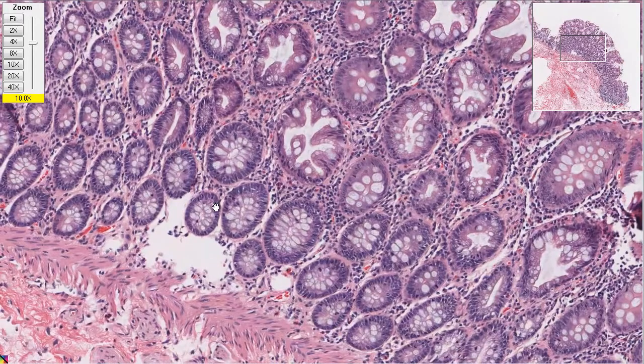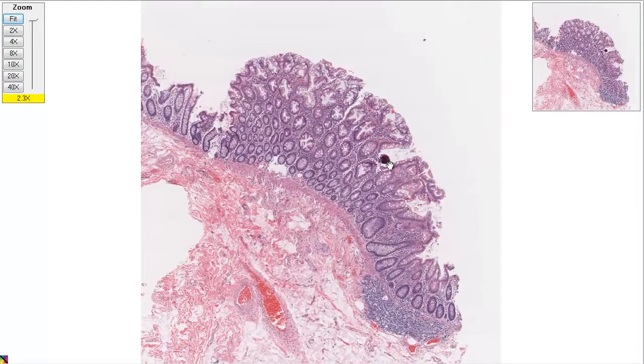There's some stimulus that was causing these cells to do that. It might have been diet. It might have been some chemical. We're never really sure what, because so much of it is things that just float on through, so it's really hard to know. But this is probably too much growth in response to an irritant.